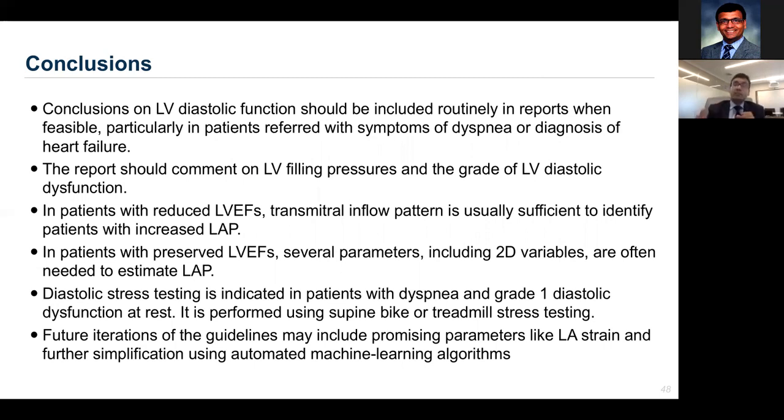And since there is more and more importance to the filling pressure, because that's the one factor that you can treat or manage in patients with heart failure, the guidelines stress variables that will look into the presence or absence of elevated filling pressure. The elevated filling pressure and the grading of the LV diastolic dysfunction should be commented upon, therefore.